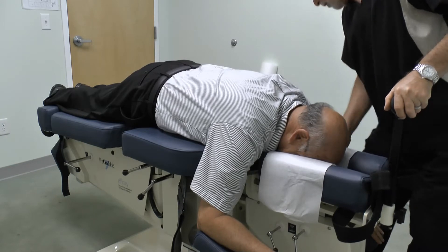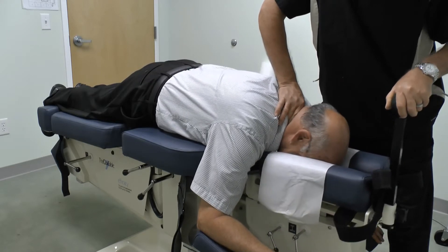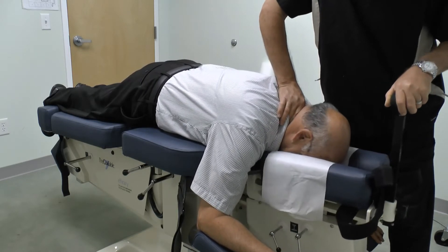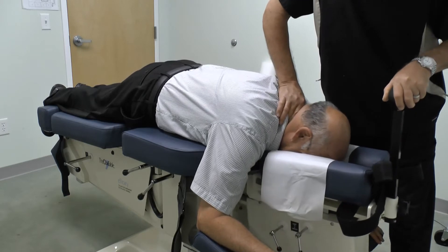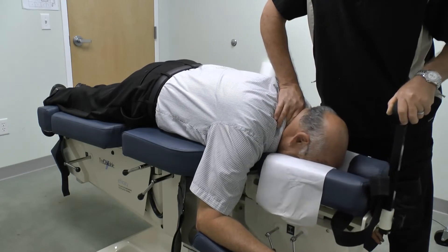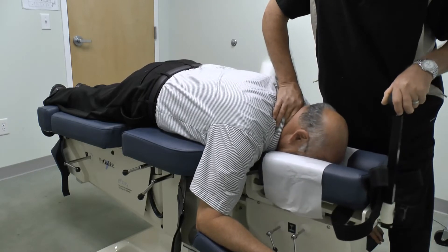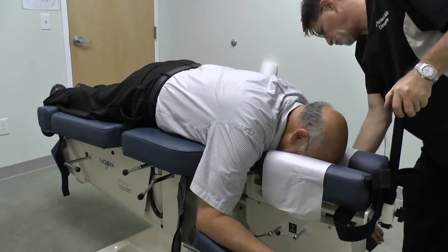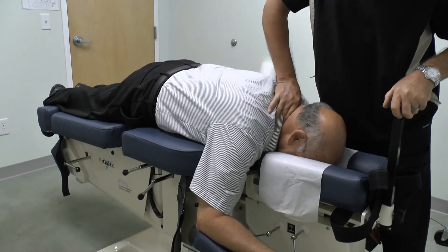Next movement is circumduction under long y-axis. After circumduction we'll do some extension on the long y-axis.